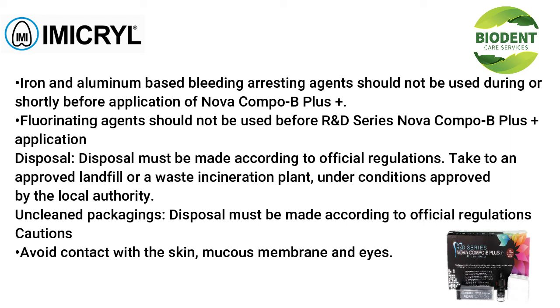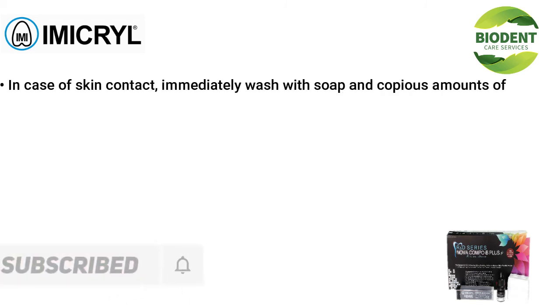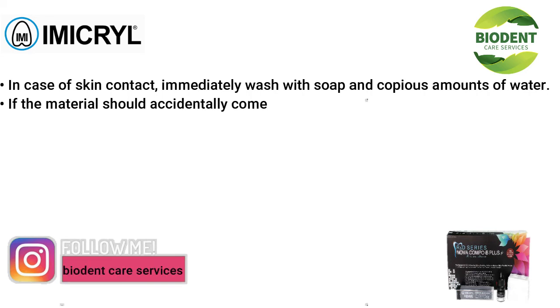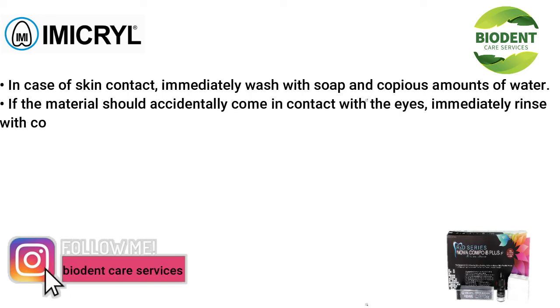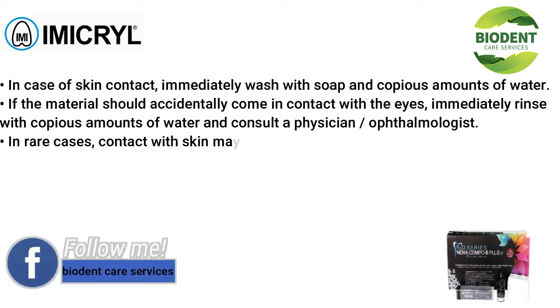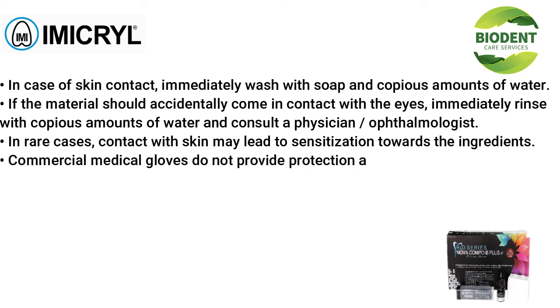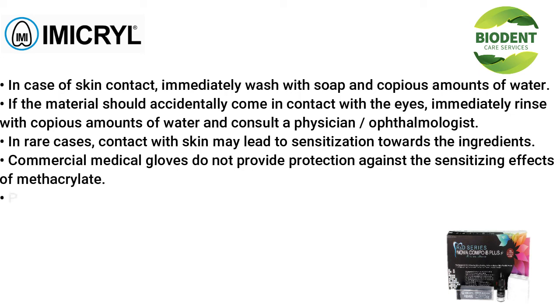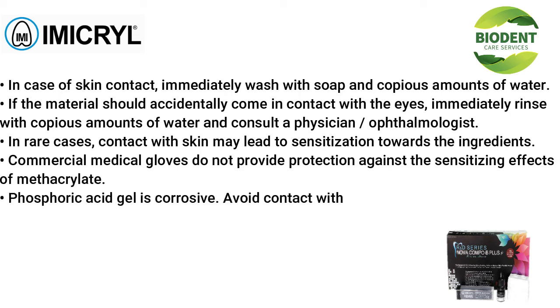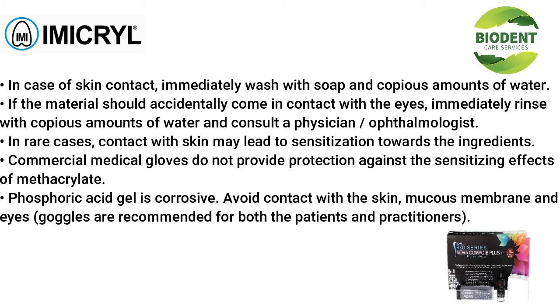Cautions: avoid contact with the skin, mucous membrane, and eyes. In case of skin contact, immediately wash with soap and copious amounts of water. If the material should accidentally come in contact with the eyes, immediately rinse with copious amounts of water and consult a physician ophthalmologist. In rare cases, contact with skin may lead to sensitization towards the ingredients. Commercial medical gloves do not provide protection against the sensitizing effects of methacrylate.